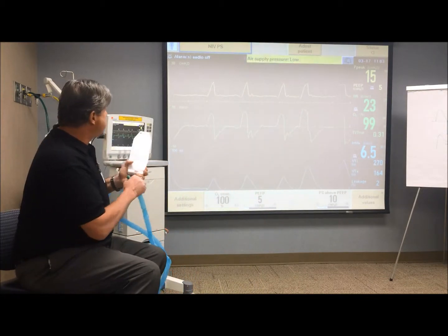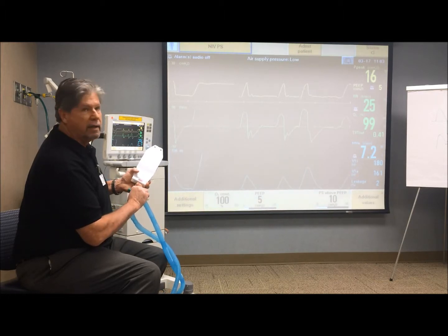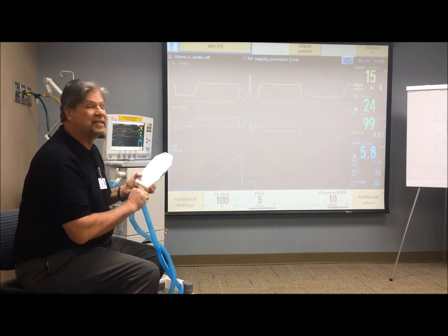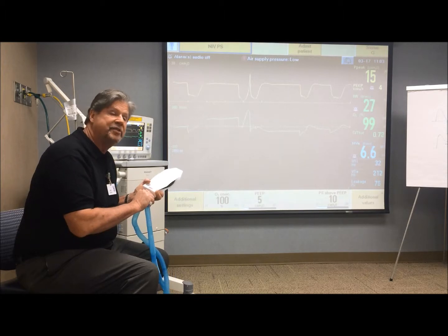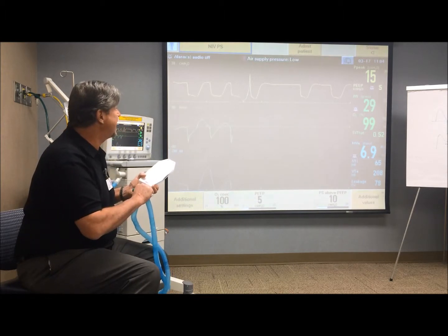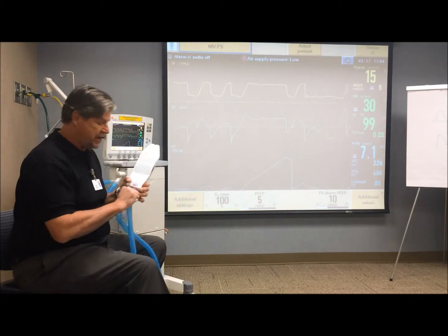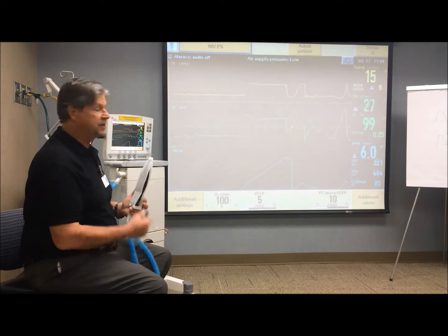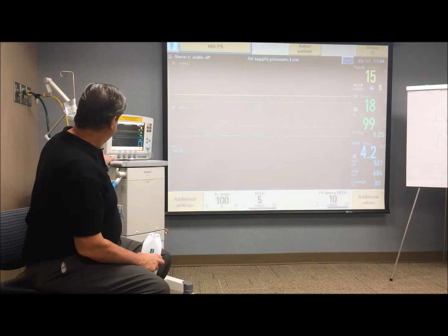If he has a leak, a big leak, the flow never gets to that 30% point. There's a secondary cutoff point, which is I time, and so the ventilator will go for 2.5 seconds and then go to exhalation. That's secondary, but by that time your patient is a little agitated because he's getting blown at for 2.5 seconds, right?